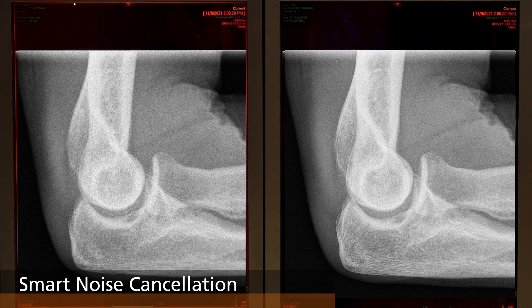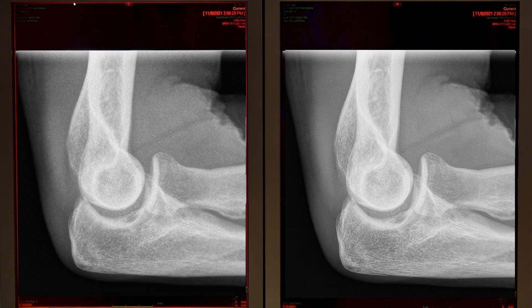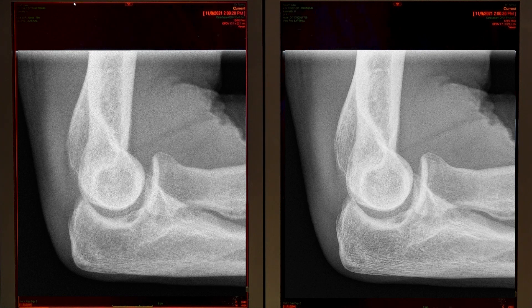Smart noise cancellation is our newest advanced imaging capability. It uses AI deep-learning technology to separate the noise from the signal, then subtracts the noise from the image. On the left is an image with default processing, and on the right is the image with smart noise cancellation applied. Some benefits include improved anatomical clarity, preservation of fine detail, and better contrast to noise ratio for images acquired in a broader range of exposures. It also enables customers to lower radiation dose without a loss of image quality when compared to our standard image processing.